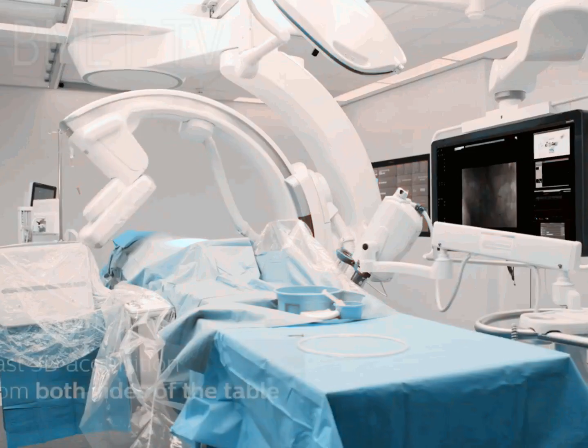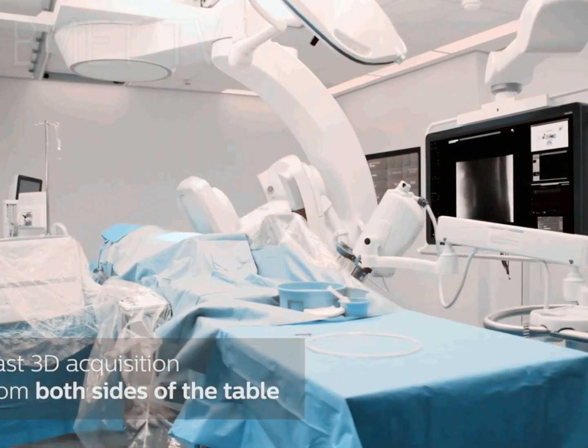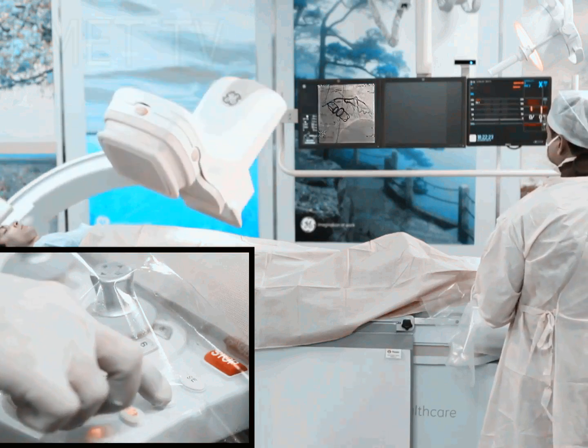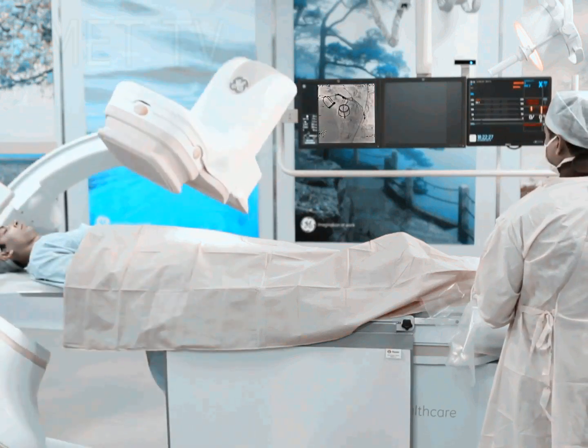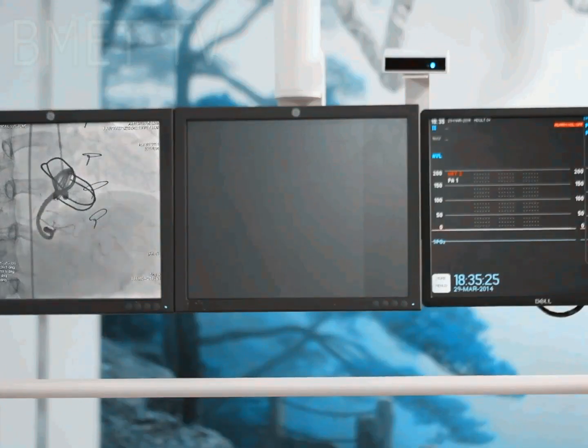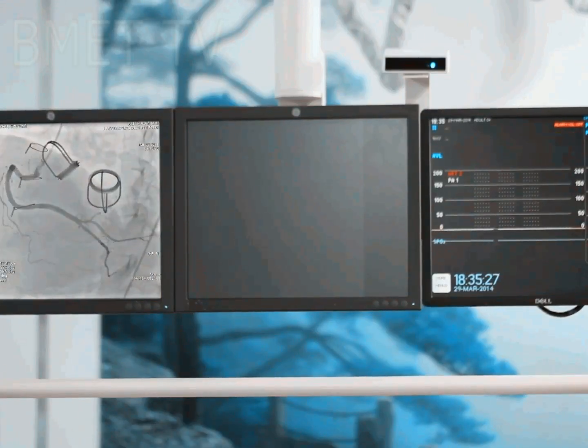The X-ray switching and pulse controller is a cath lab part which sets the X-ray generator in on-off sequence, both in the fluoroscope and the cinemodes. A specialized digital image processor with program selector is an important cath lab part that can contribute a lot to the diagnostic value of the cine recording and the fluoroscopic imaging.